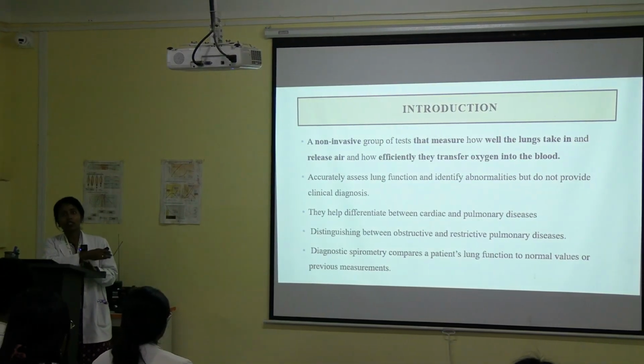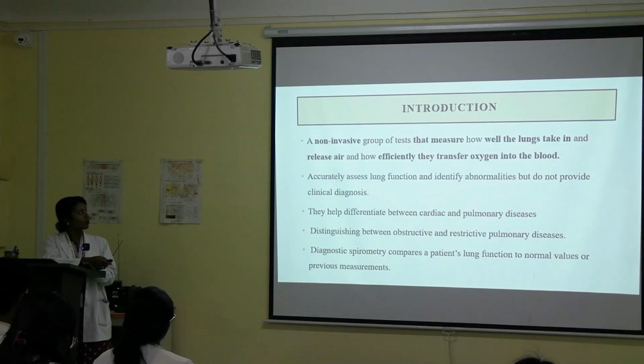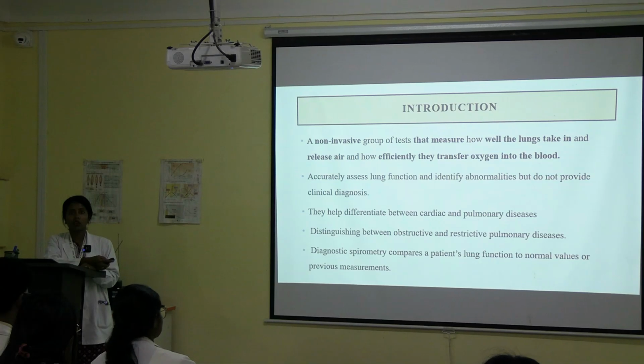By this you can come to know whether the pathology is in the lungs or not. They help to differentiate between cardiac and pulmonary diseases. They distinguish between obstructive and restrictive lung diseases. I will show you the graphs later on.